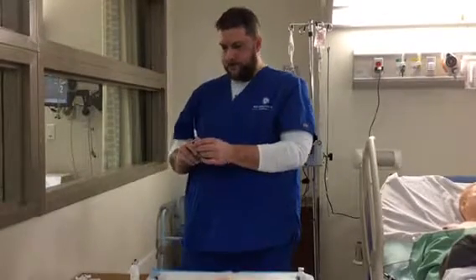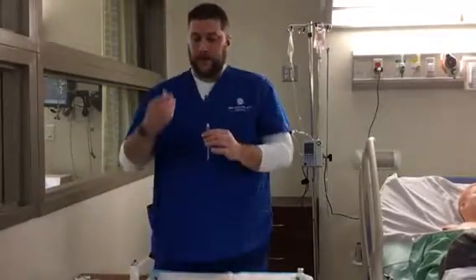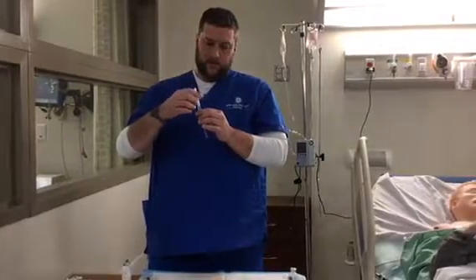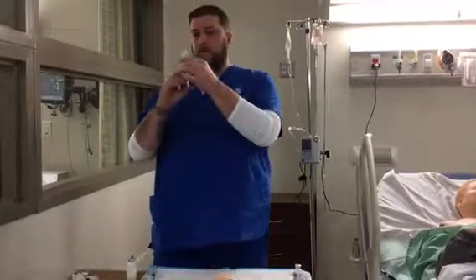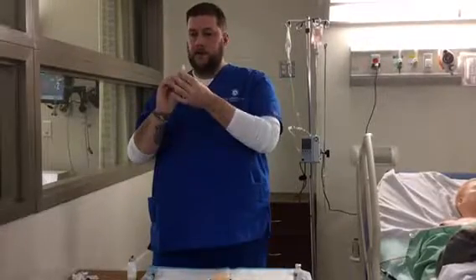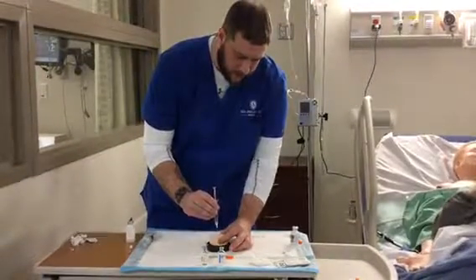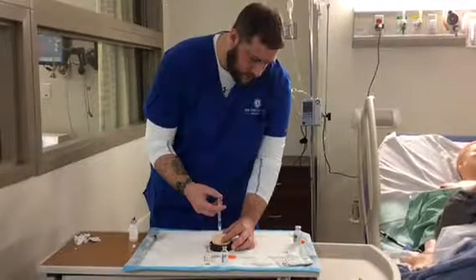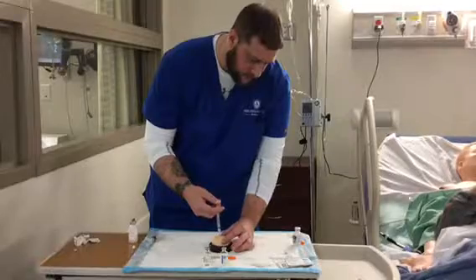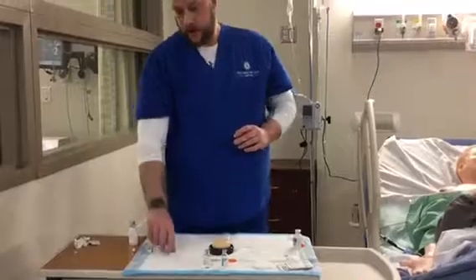Once the air is gone, I will remove the filter needle, and I will replace it with the regular needle. At this point, uncap it. Again, making sure there's no air in it, and it's going to be done the same as all the other ones. Push up on the skin, and insert it at a 90-degree angle, straight in. You want to expel the medication into the skin, relax, and withdraw. And again, this would be put in the appropriate location. And that's how we do the med administration.